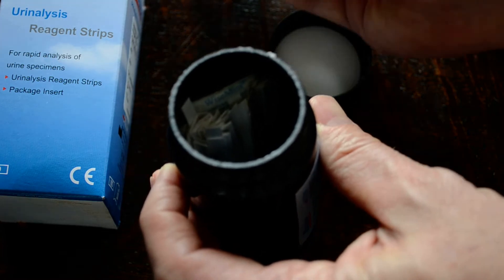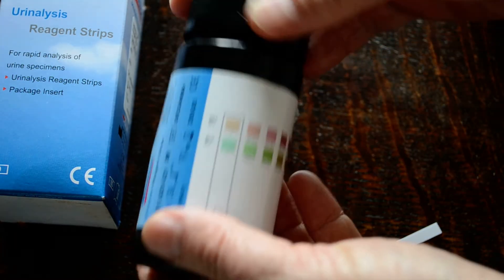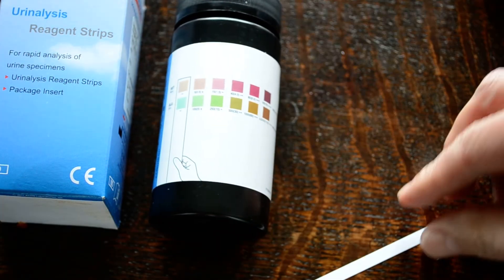So when you're ready to test, remove your seal, remove a test strip, and put the lid straight back on. That's very important to keep these tests dry. The worst thing you can do is leave these in a steamy bathroom.